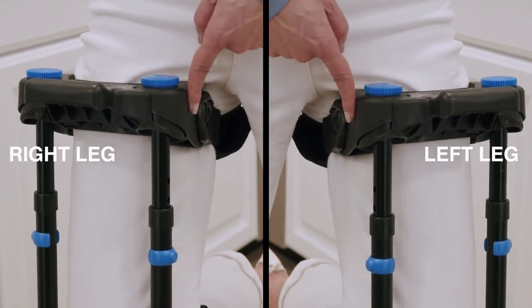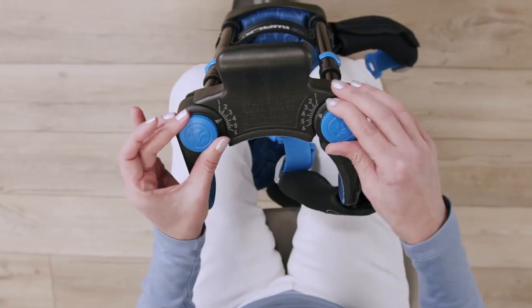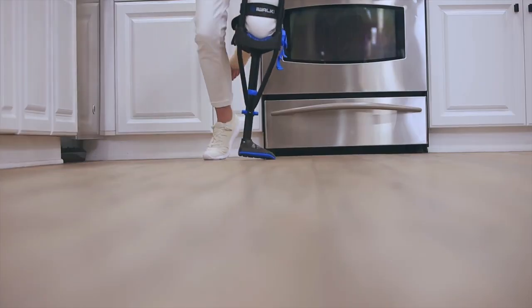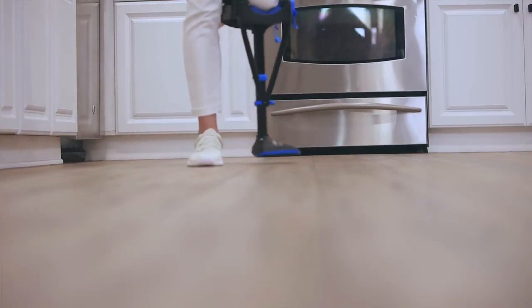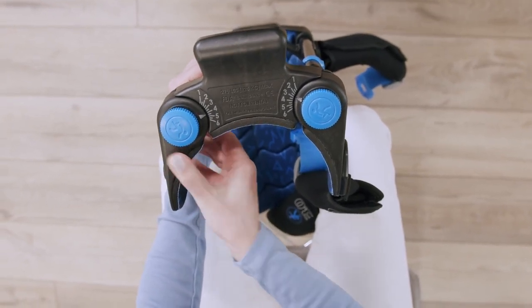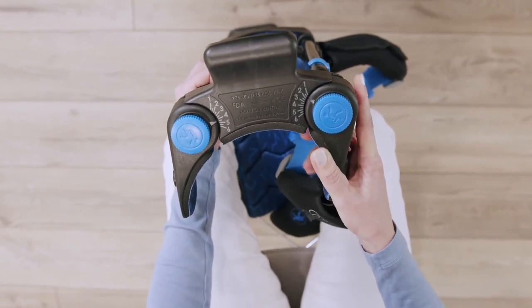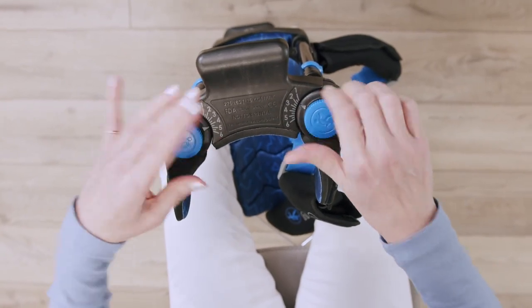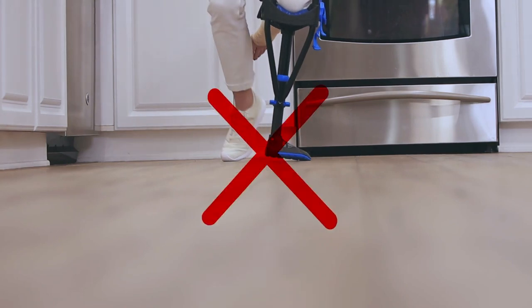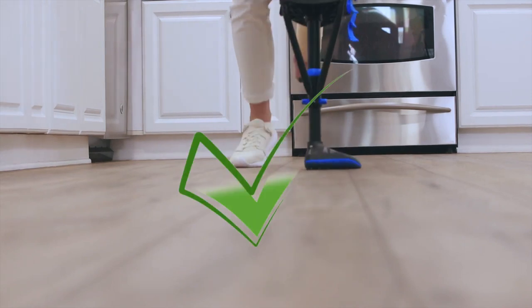First, note that you have both an inner thigh support and an outer thigh support. Take the crutch off and loosen the thumb screws, noting your initial numbered settings. If you're walking on the outside edge of the foot, lift and rotate the outer thigh support outwardly to increase the number setting by one. Finish by rotating the inner thigh support inwardly to decrease the number setting by one. Then tighten the thumb screw and test your new settings. If you're still walking on the outer edge of the foot, repeat the process until you're walking with the entire width of the tread contacting the ground.